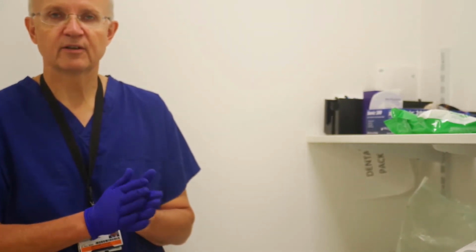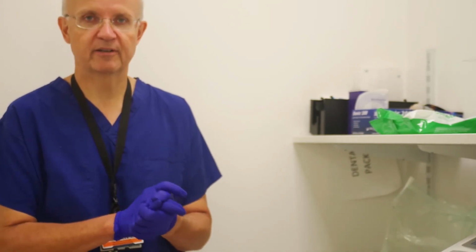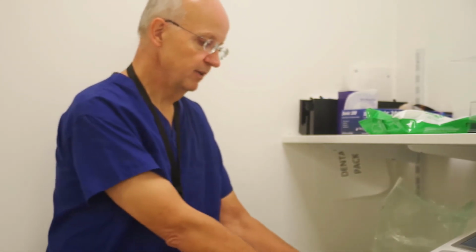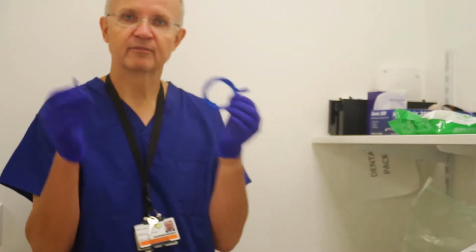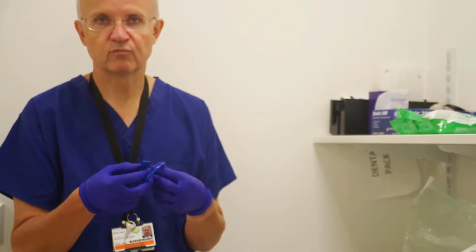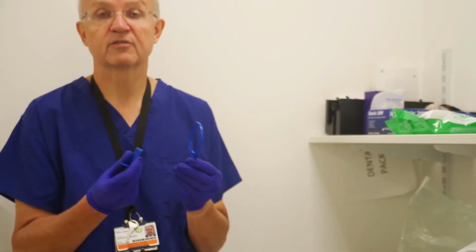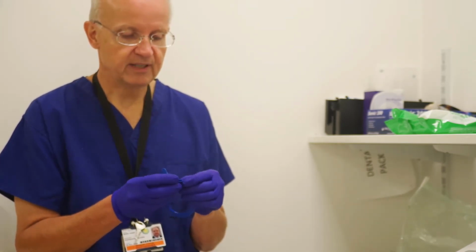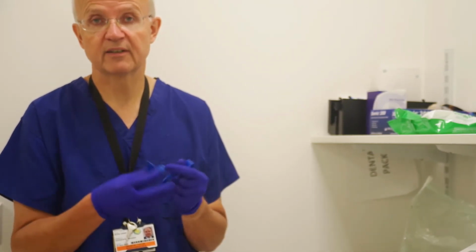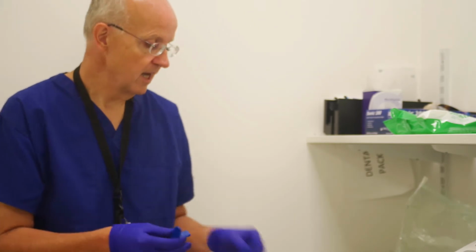Okay, thank you, Carlin. So I'm now just going to take you through setting up the holder for the anterior periapicals. The posterior one is coloured yellow, and the anterior one is coloured blue. And this is in the RINN system, RINN holders. You'll find that a lot of other manufacturers have adopted those colours, but some have gone slightly different shades. But these are the ones that we're going to be using throughout your 5 years here, and they also use them at the other sites that you'll go to, for example, Southend and the Barclaycard Centre.